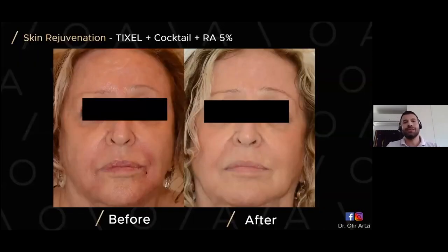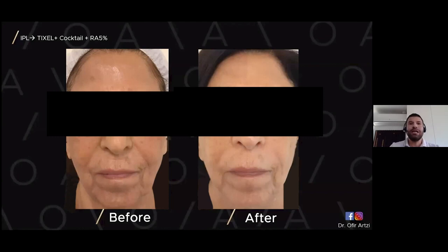I usually use the Tixel in a lower setting. Still, I consider it to be a high setting with different cocktails. So different biopeptides, different drugs, mainly tretinoin 5%. I really like to combine my Tixel with other modalities. One of the main protocols in my clinic is IPL. It doesn't really matter which IPL you use. I have 4 IPL devices in my clinic, so I tried it with all. So IPL followed by Tixel. Usually my setting is 10 milliseconds and 500 to 800 micrometer protrusion. I usually apply biopeptide, a combination of, again, different countries have different formulations. And I just top it with tretinoin 5%.